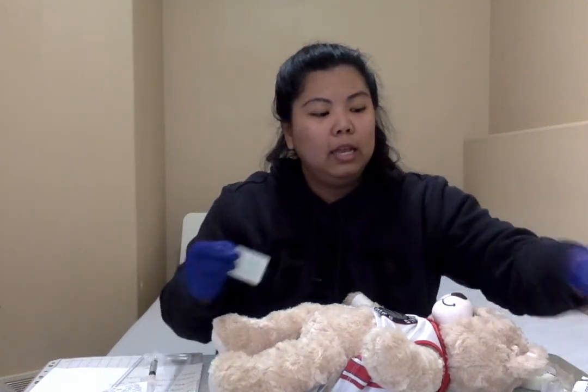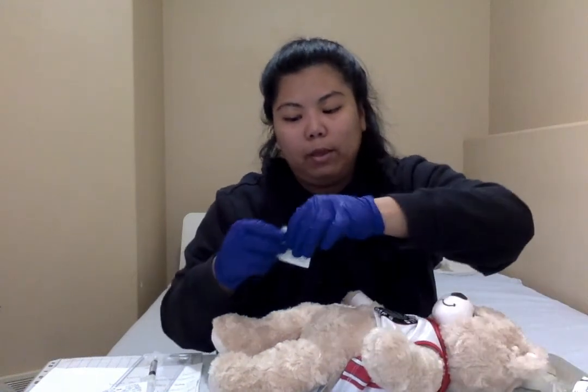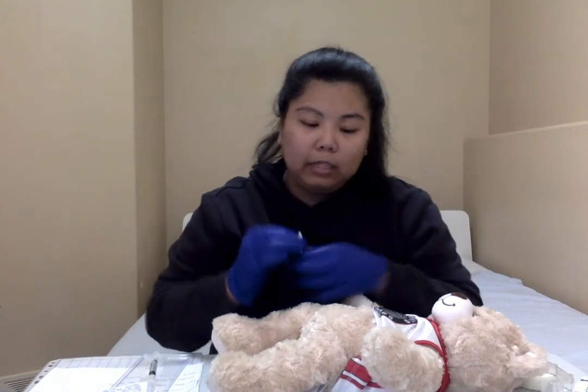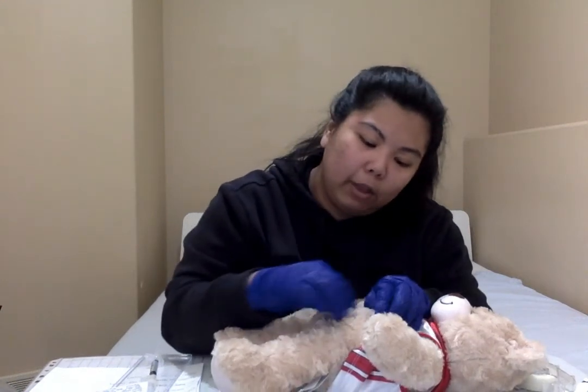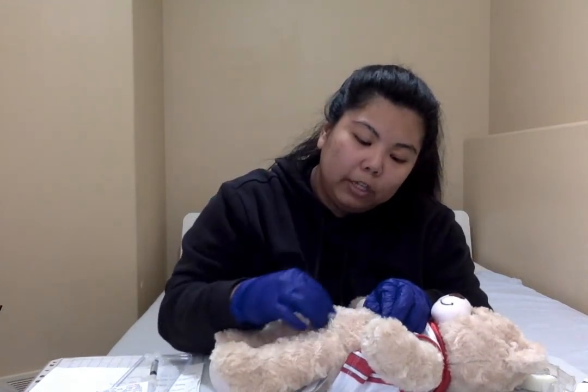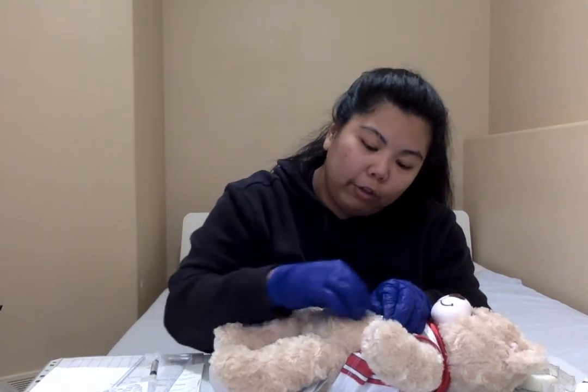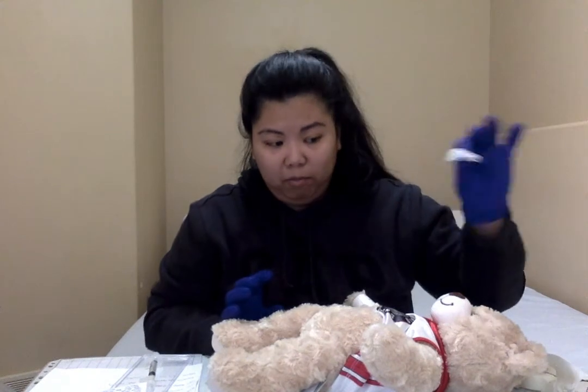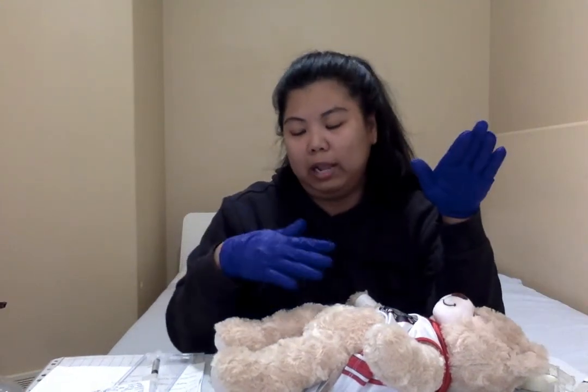We want to clean the injection site with an alcohol swab again for a good 30 seconds. We're going to do that in a circular motion, starting from the inside, working our way out. And we want to make sure that it's all clean, again for 30 seconds. And then let's pretend that I've been wiping it for 30 seconds, and then we want to let it dry before we start injecting.